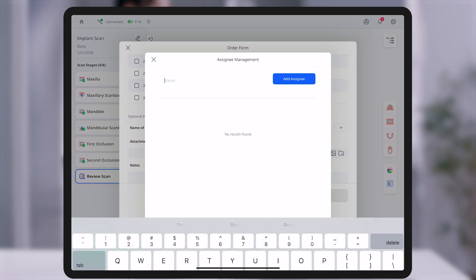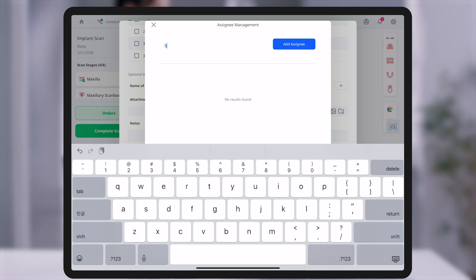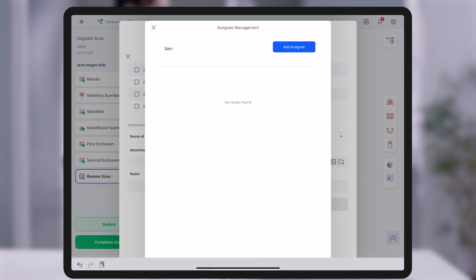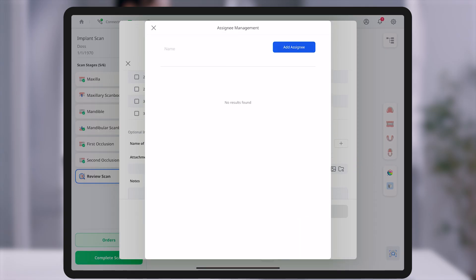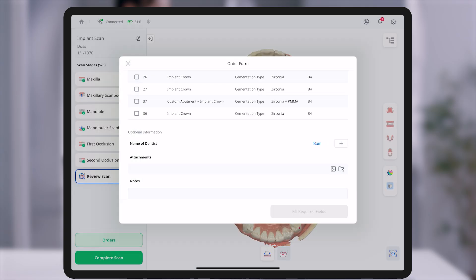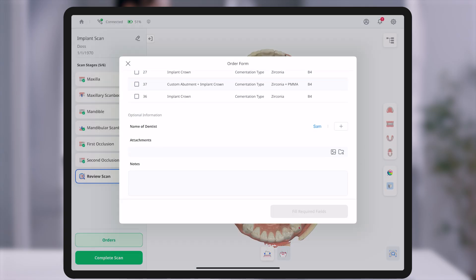Additionally, selecting an assignee allows you to clearly specify the contact person, helping improve communication with the dental lab.